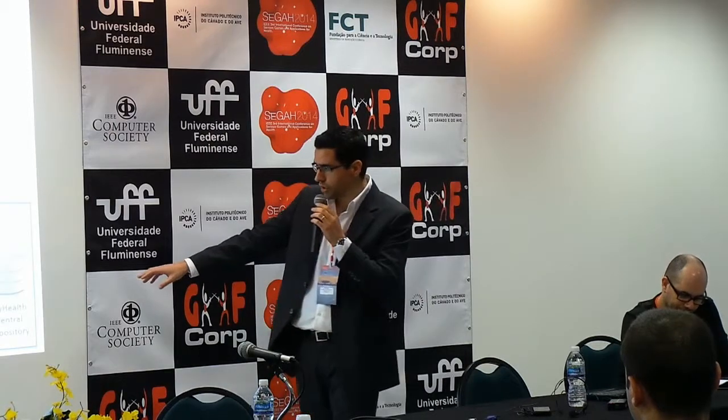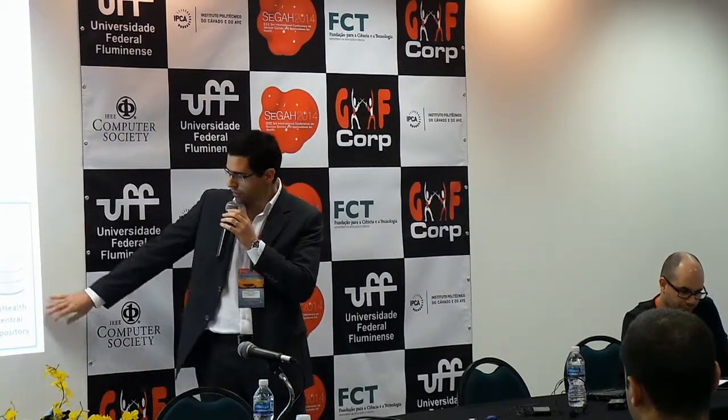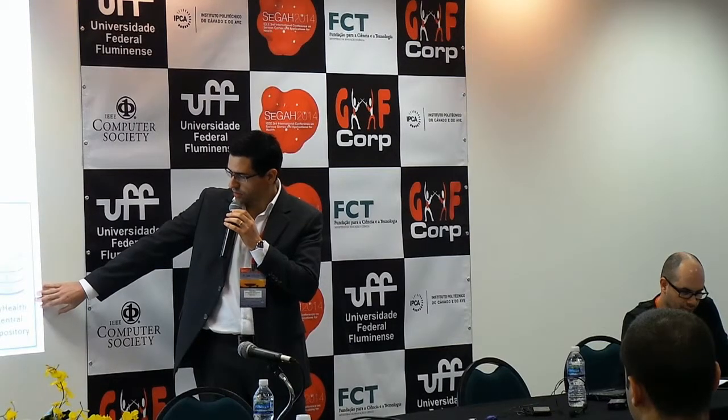He can receive some interpretations, some measures about his EEG, but at the same time he's sending data to the physician, to the medical doctor, that can actually acquire some diagnosis, or that can give some extra information to the patient based on the EEG. So this has been developed in a large project that is being developed in Portugal, at the University of Minho.